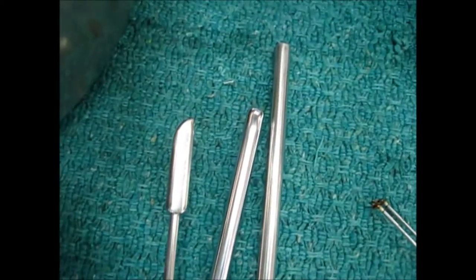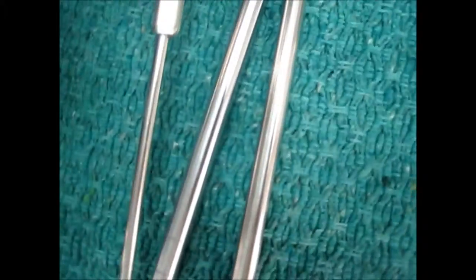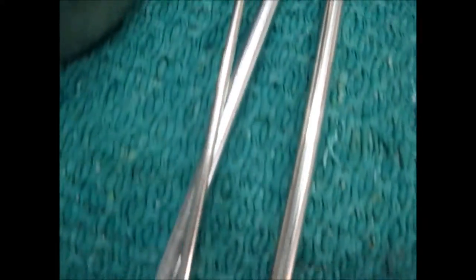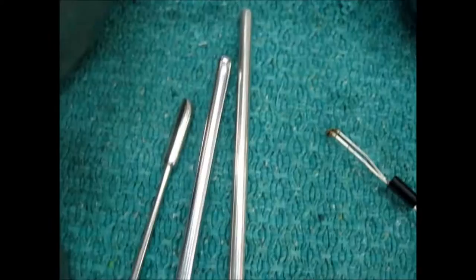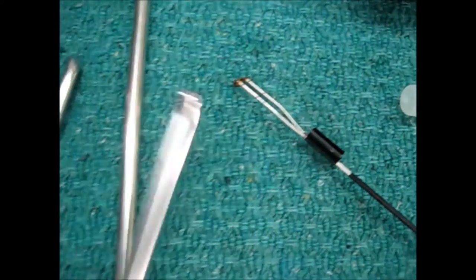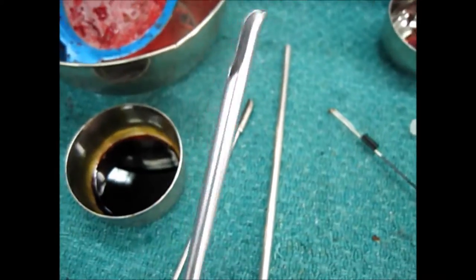These are some of the instruments which we use during the cystoscopy. These are the three cystoscopes, 25 number and the other number. See, there is a cut in the packs.